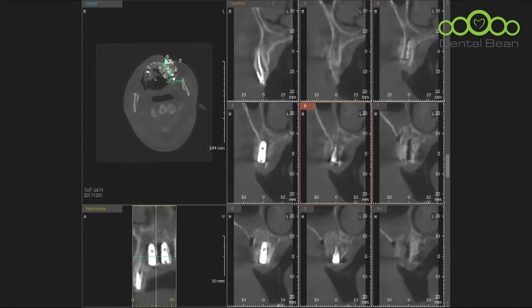Next. Okay, left premolar, same situation after splitting, although the thread was not exposed, the buccal bone wall thickness looks less than 1 millimeter, then this is not good. Maybe the patient will experience resorption, so I tried GBR again. Next.